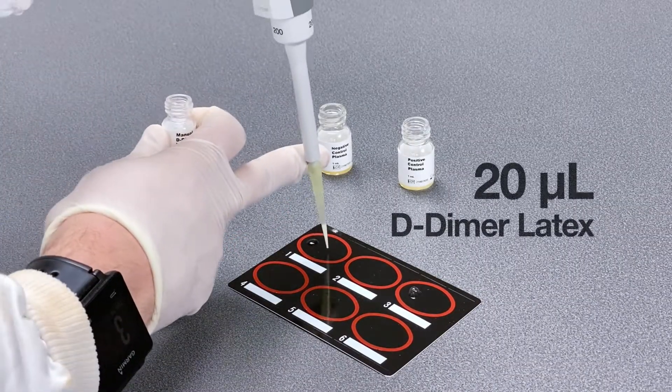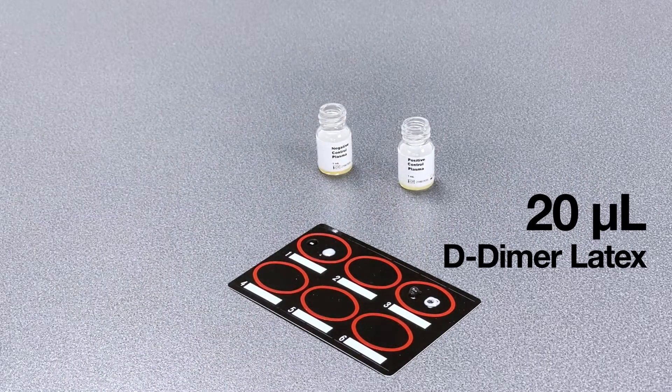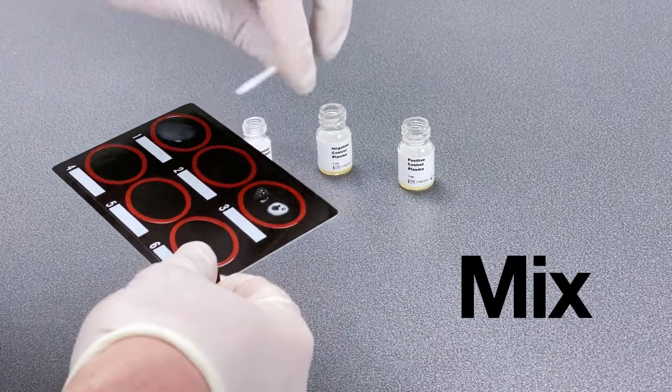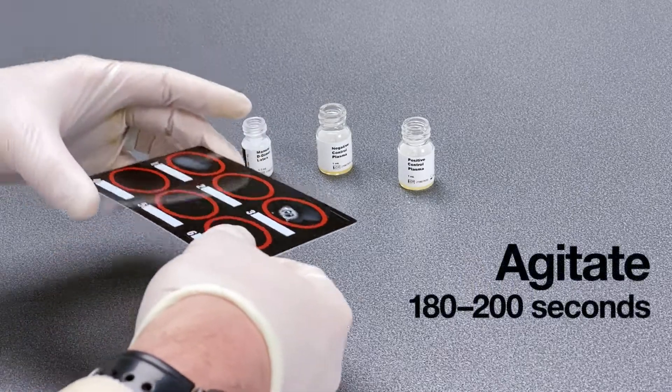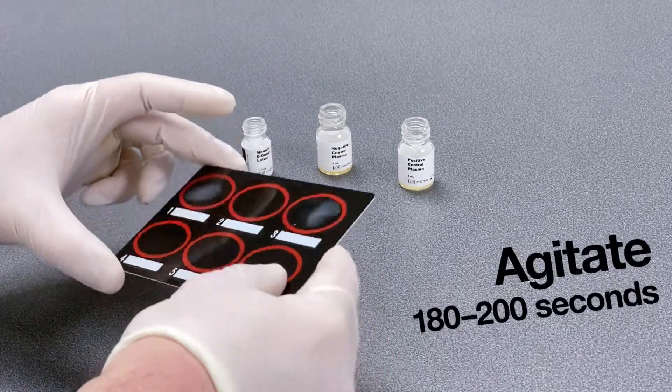Then pipette 20 microliters of latex suspension to each area as shown. Quickly mix the contents of each area using the supplied mixing sticks. Agitate the test card gently as shown for between 180 and 200 seconds.